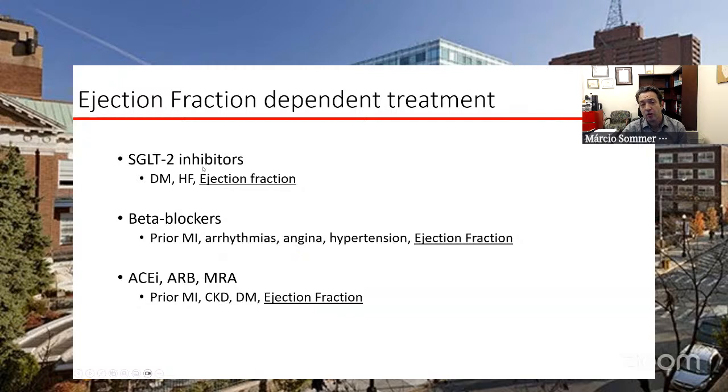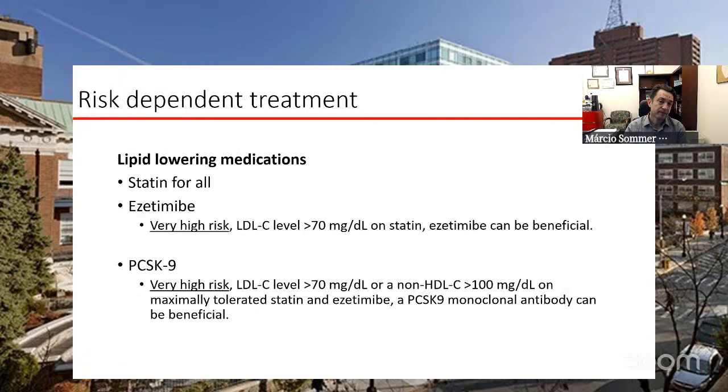So essentially, for all those medications, maybe you need an echo for the EF, but all other information to decide on the management is clinical. There's no additional invasive or non-invasive need for testing other than knowing there is CAD, which could come from a CT. Lipid-lowering medication, statins are for all. Ezetimibe and PCSK9 by the guidelines are LDL plus risk, which CT can give you. As I showed you, the risk derived from a CT is comparable to a functional test. So you can guide those decisions essentially based on the clinical profile plus the CT information.